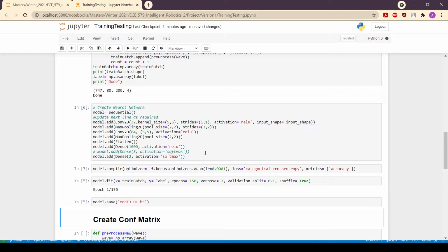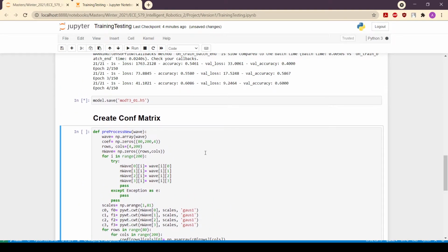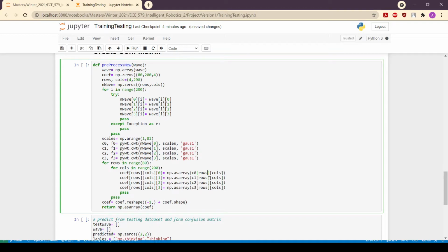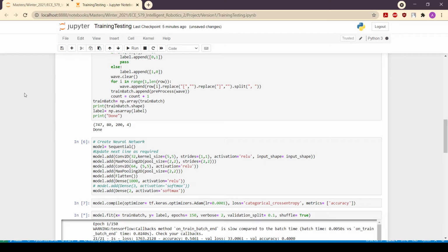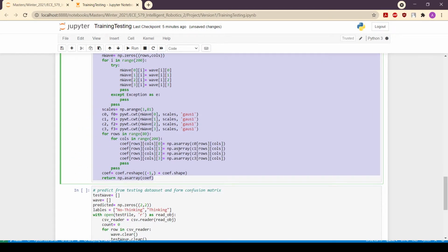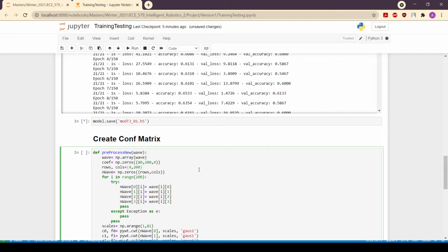After saving the model, here is the second pre-processing function. It performs exactly the same as the previous one, but the only difference is that it changes the shape. The reason for creating this new pre-processing function is for predictions. The previous function was to train the neural network, which needs a specific structure of dimensions, as you can see here. So it was trained with these dimensions, but while testing it needs a different set of dimensions. So this function does that part.